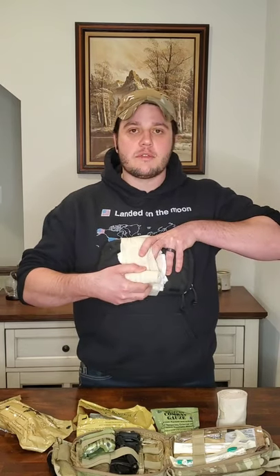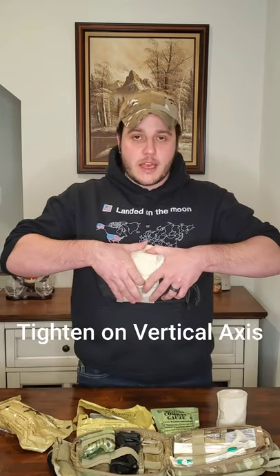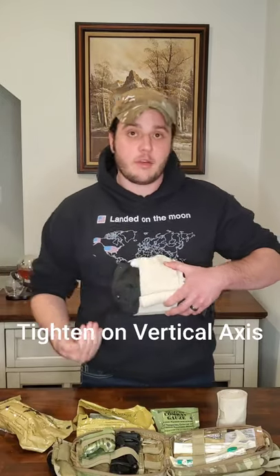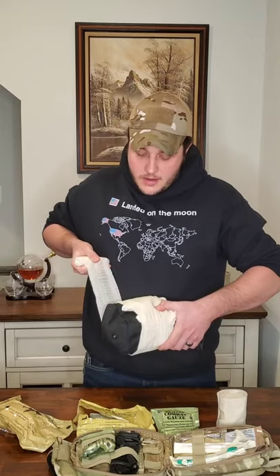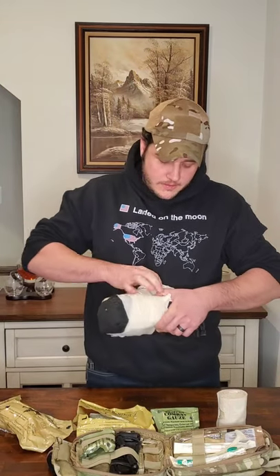Once you have that first relatively loose securing wrap, move to your compression wraps. You're going to tighten on the up and down axis of the wound — as you wrap down one side and up the other, pull when you're on those axes. That's what applies the pressure. You're trying to cover the edges of the bandage so nothing gets in. Tighten on the down axis, wrap around, tighten on the up axis, and repeat until the wound is completely wrapped.